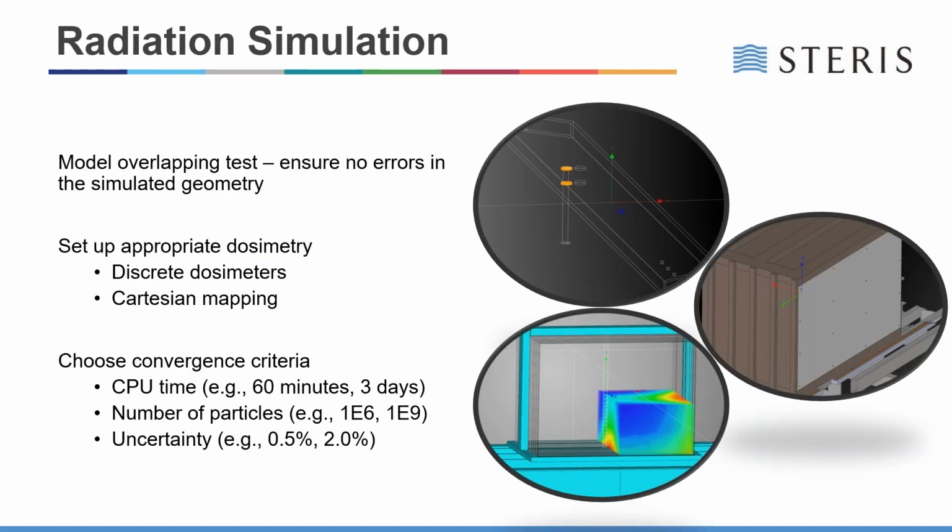So we've made it halfway through our outline from the beginning of the presentation, and it's clear that a tremendous amount of work goes into constructing a firm foundation upon which to perform simulation. A few steps remain before we can really get the fruits out of this labor. And the first would be making sure that there are no geometry errors within the simulation.